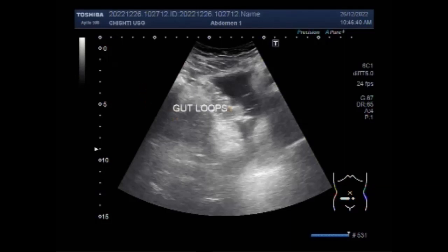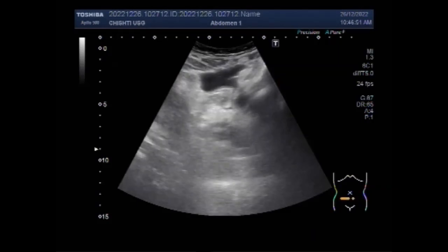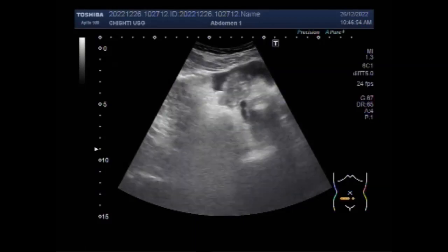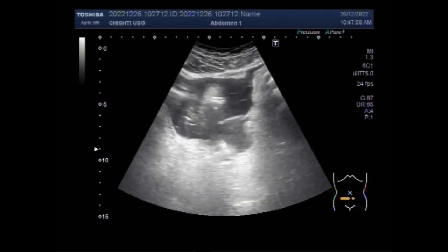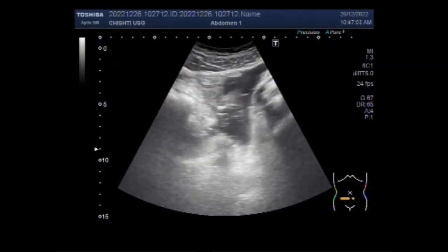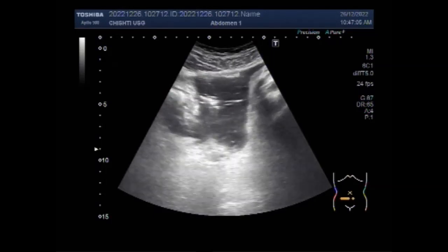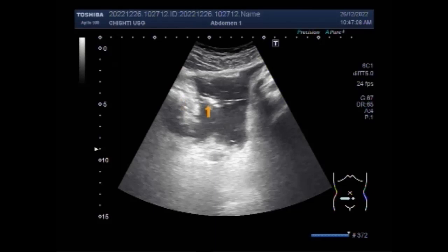You can see the gut loops. The patient is examined with a standard 3.5 megahertz probe, and you can see free fluid in the lower abdominal cavity in the area just above the urinary bladder. A small perforation is seen with small adhesions, and free fluid is present.